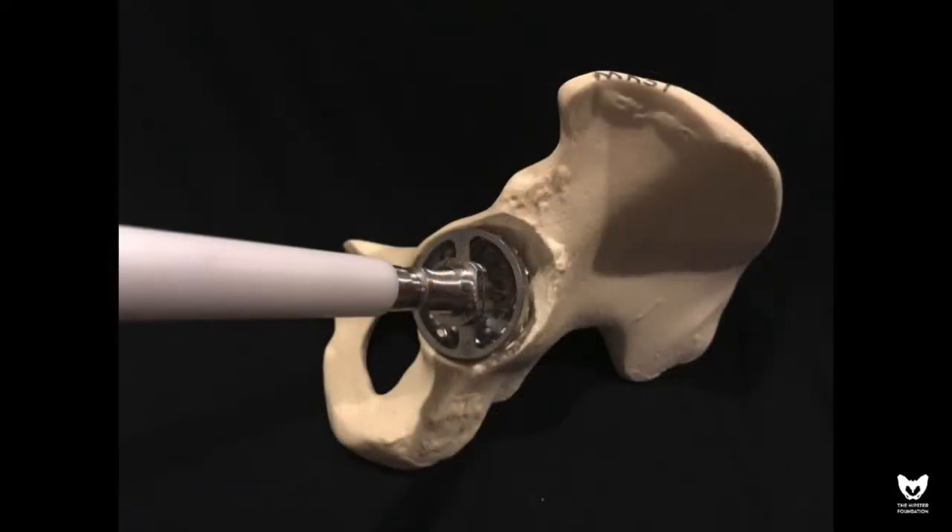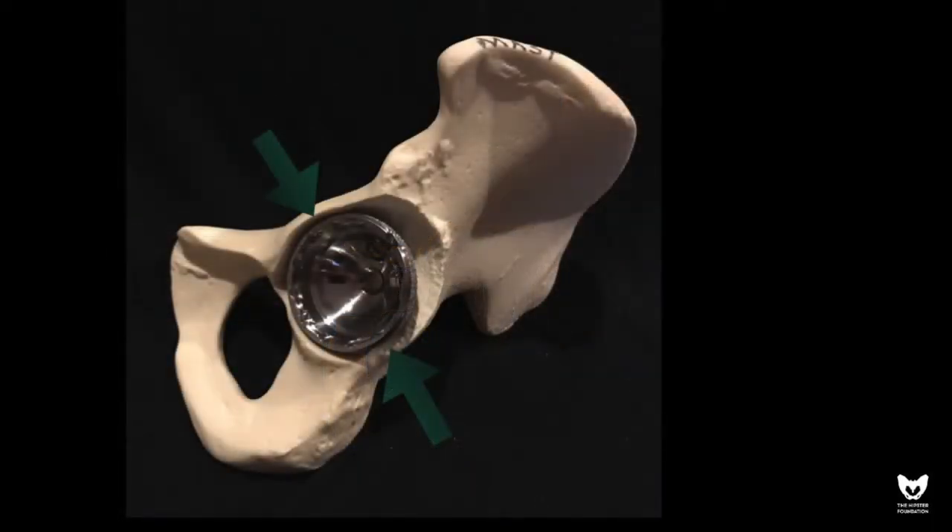The second step is to take the same reamer and direct it more distally at the level of the teardrop to place the hip in the anatomic hip center. The definitive acetabular component is then opened and placed in the anatomic hip center in anticipation of a large superlateral defect. The goal of fixation is between the anterior and posterior columns as depicted here.